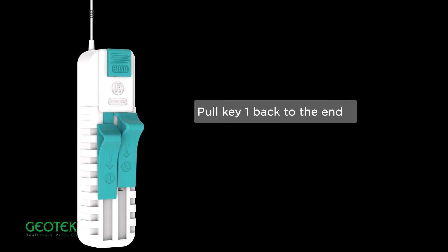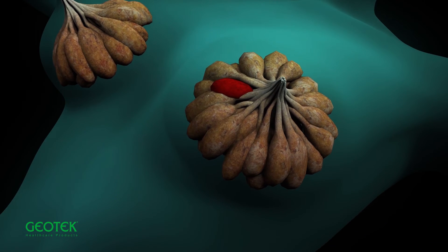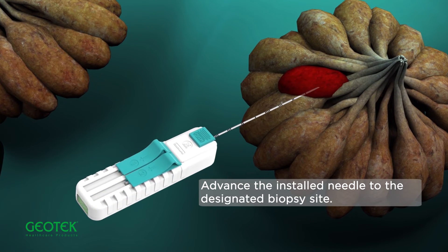Pull key one back to the end, pull key two back to the end. Advance the installed needle to the designated biopsy site.